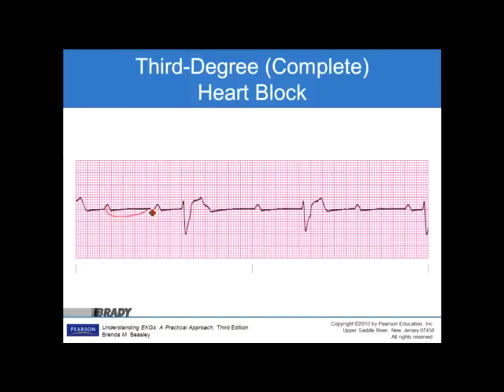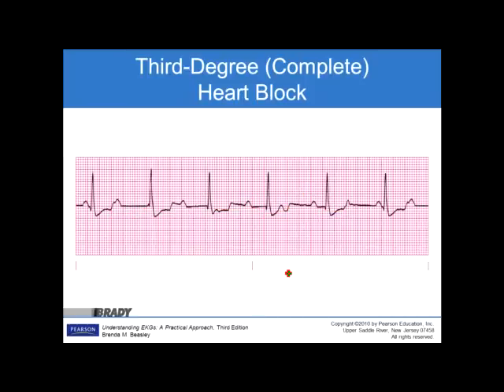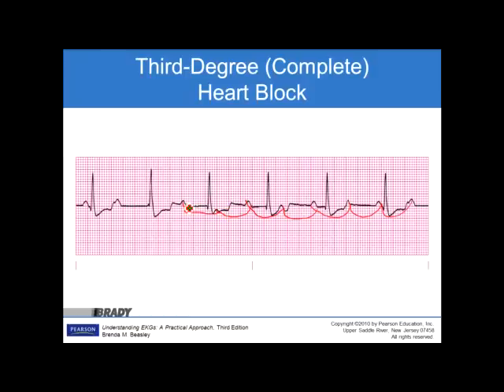Looking at the strip: many P waves firing — but again, there is no P wave before the QRS, and the QRS is wide. To identify a third degree block: no association or dissociation between the atria and the ventricles — each one of them doing their own thing. In this last example of third degree heart block: P wave, P wave, P wave, P wave — P waves doing their own thing, and the QRSs doing their own thing. Third degree block is identified by complete dissociation — no association — of the P waves to the QRSs.